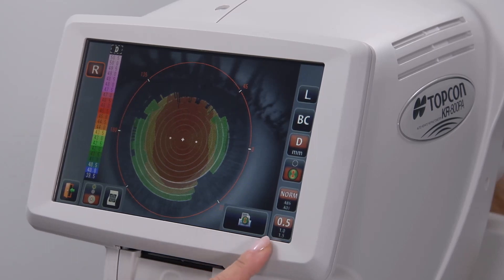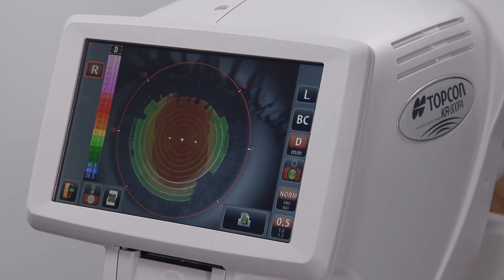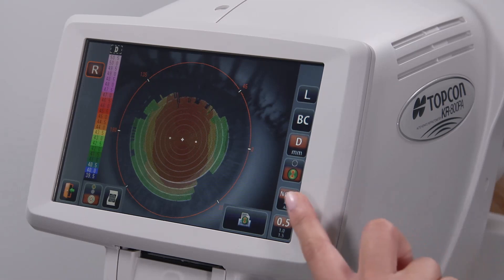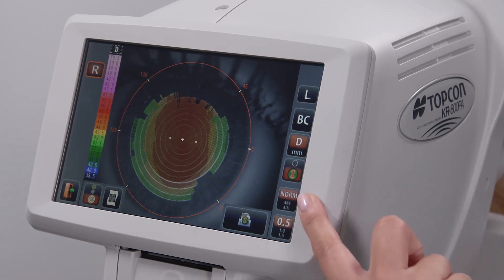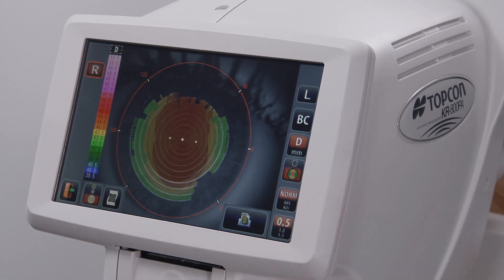The step size icon can be used to change the step size of the color scale. Smaller numbers provide more corneal detail than larger numbers. The map type icon changes the map scaling between normalized, absolute, and adjustable.